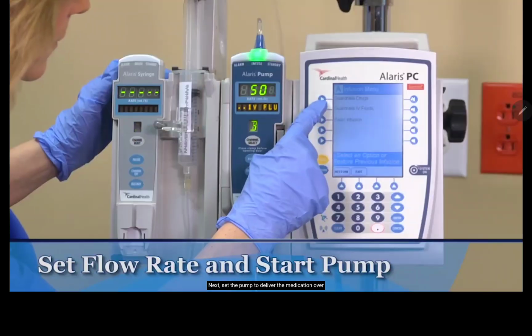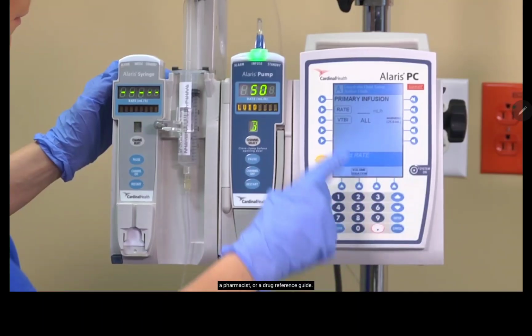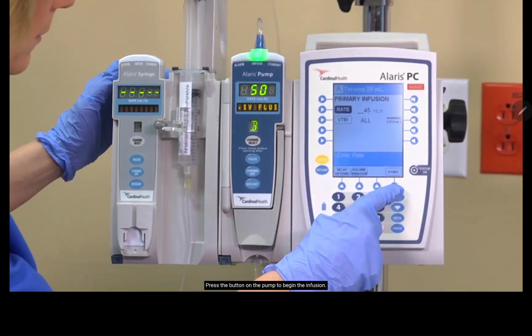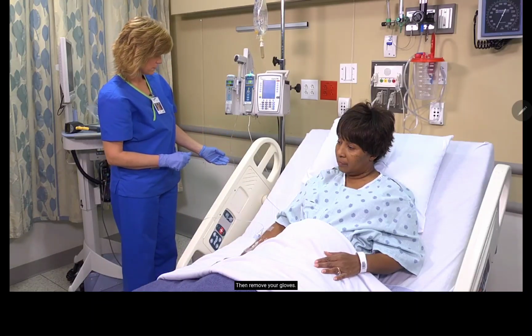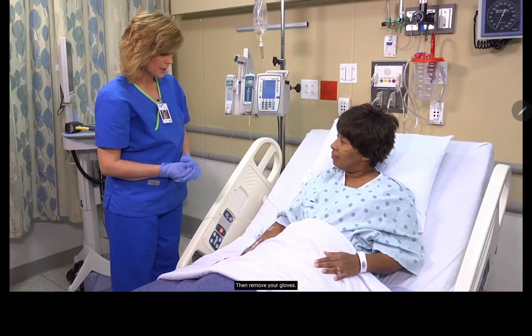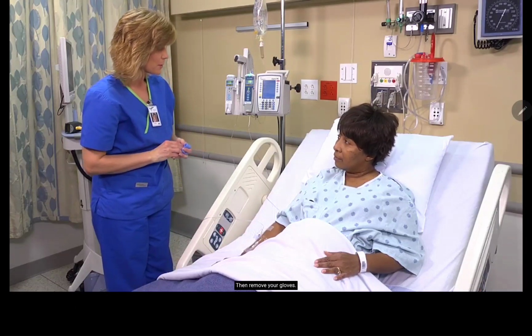Next, set the pump to deliver the medication over the period of time recommended by agency policy, a pharmacist, or a drug reference guide. Press the button on the pump to begin the infusion. Then remove your gloves. All right, ma'am, you're all hooked up. If at any time you have that tenderness, swelling, or any discomfort on that IV site, please let me know.